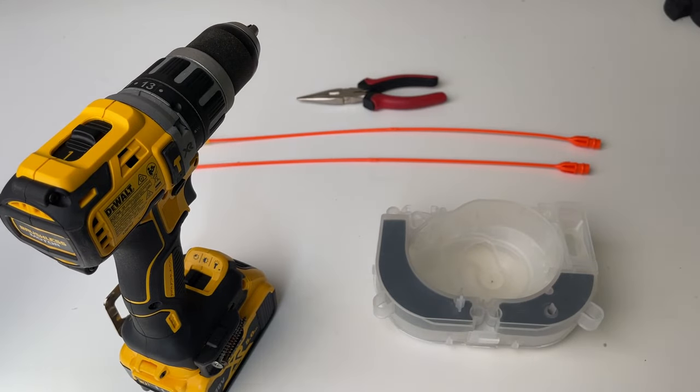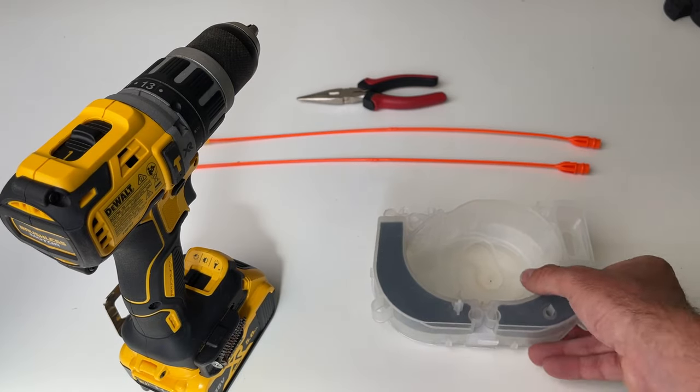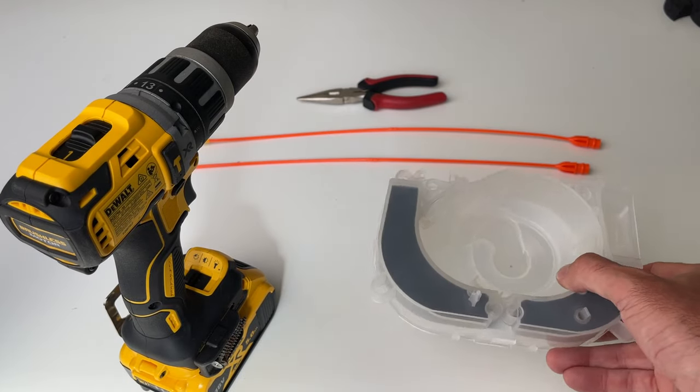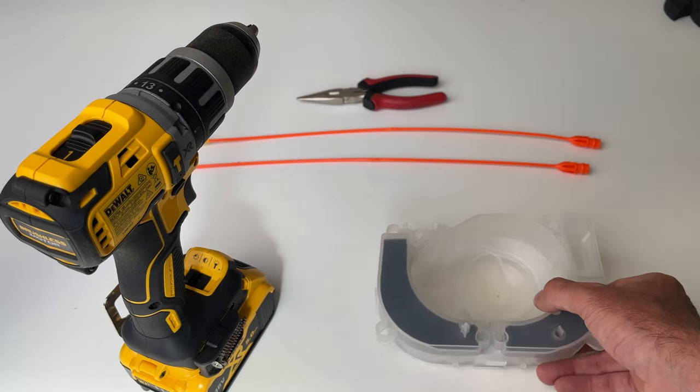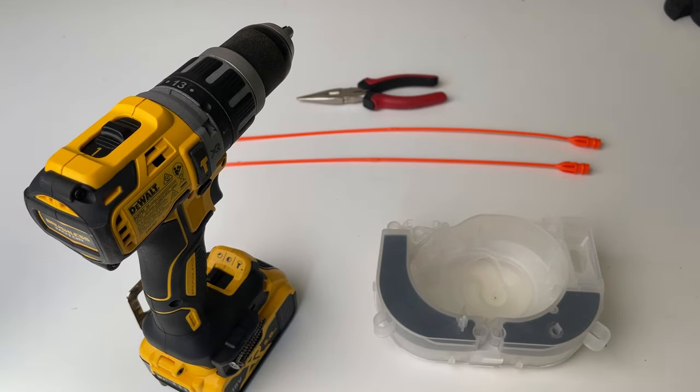Now guys, if you want to watch a video on how you can take apart your DreamStation 1, so that you can get to this component, then put it back together, just click the link above, and that'll take you to a video.